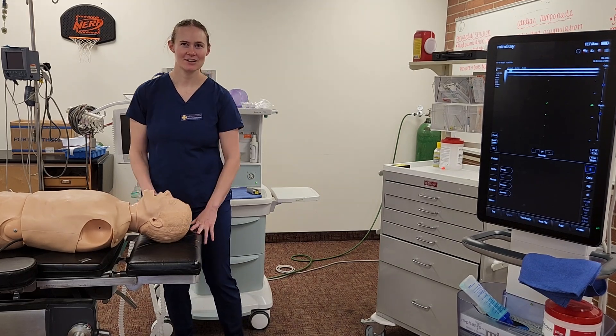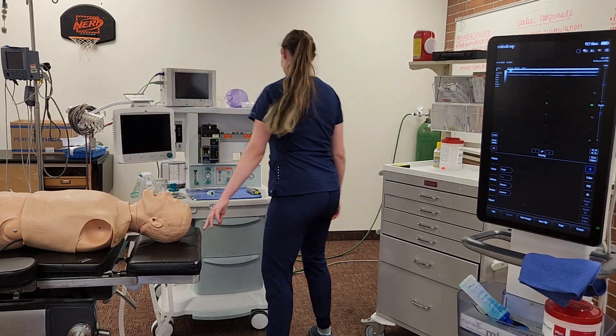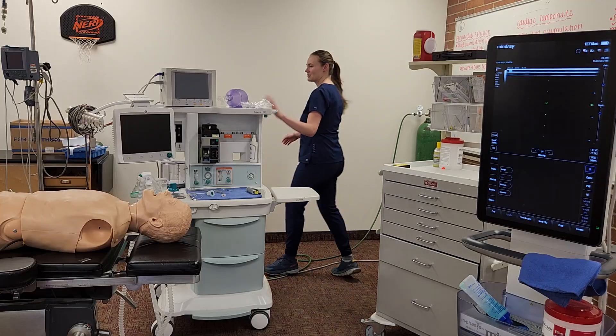Hi, my name is Evelyn. This is my nursing video. The first thing I'm going to do, because I have no IP case, is go and check my machine out.